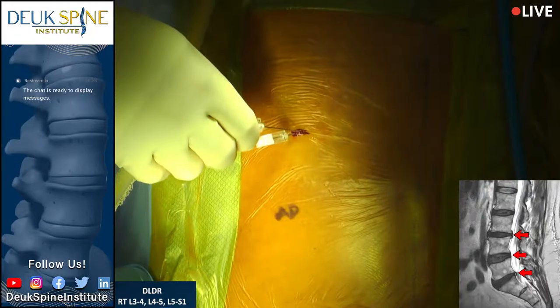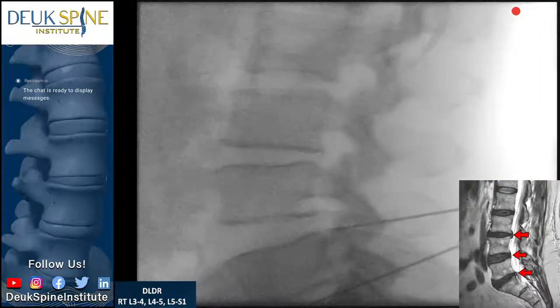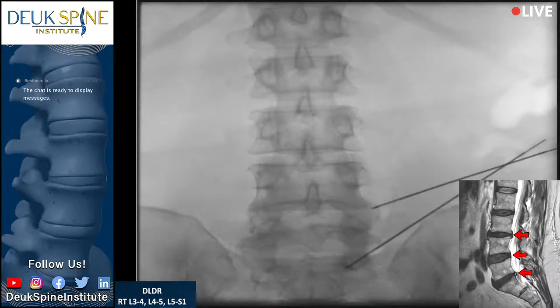All right, you can see we're very close to the L4-5. Let's get an AP. An AP means a front-back view. Right now we're looking from side to side. Now you can see this patient's spine on the x-ray looks pretty good. You can't see the herniated discs on an x-ray. You see them on an MRI.